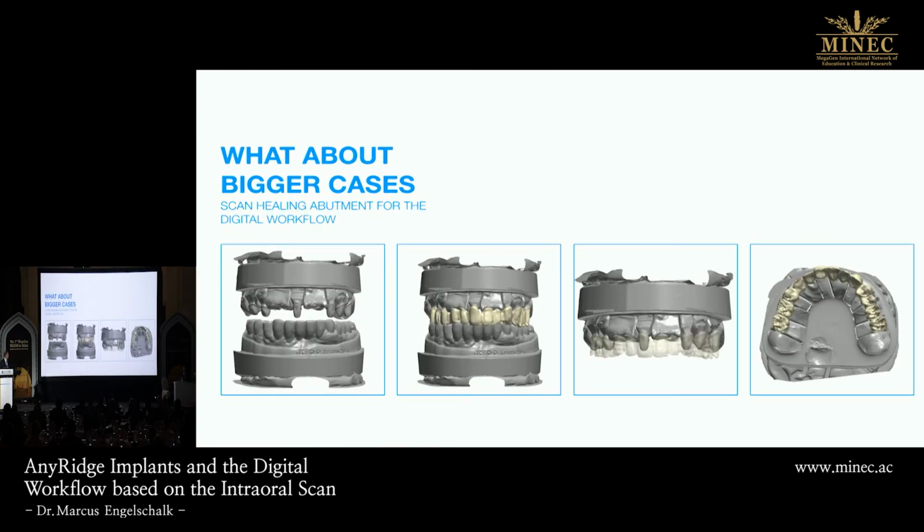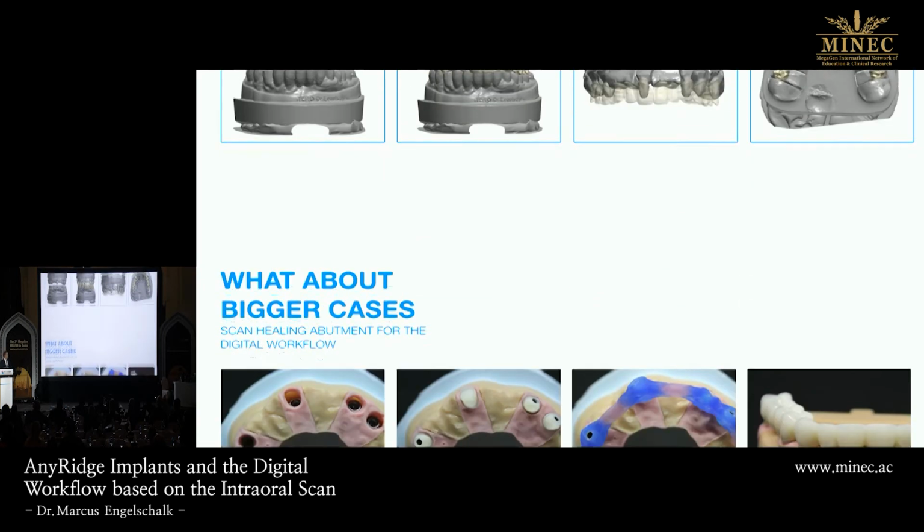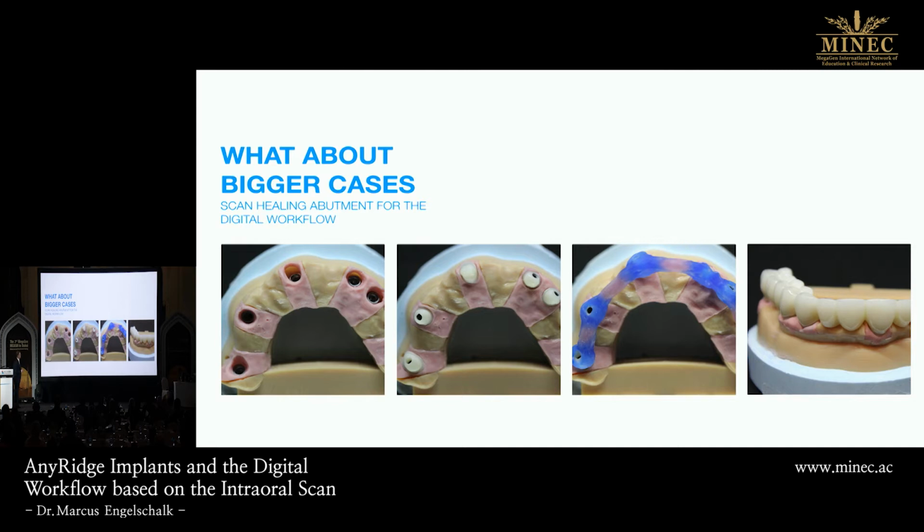So the same again. Now you see the things from the technician. Hey, you can do it very easily. The model situation, you see these abutments. In this case, it's not screwed, it's cemented, just to show you different kinds. It depends on your strategy. I don't want to discuss this topic, if screwing is better or cementing now, because I'm just having 7 minutes now.